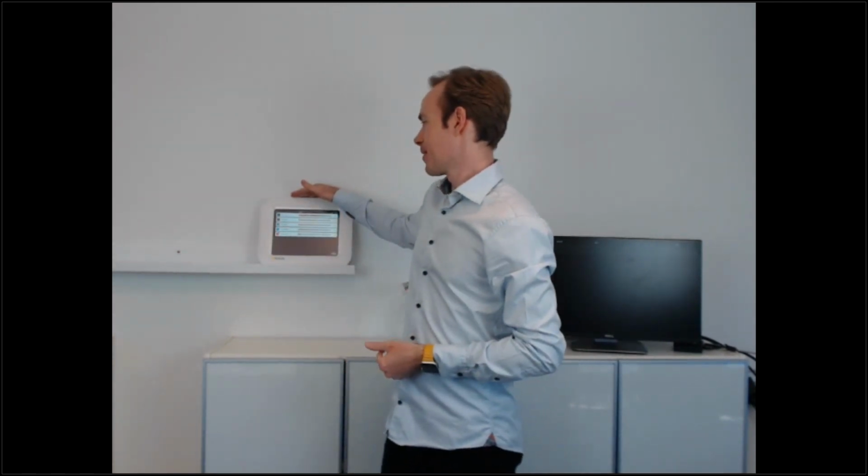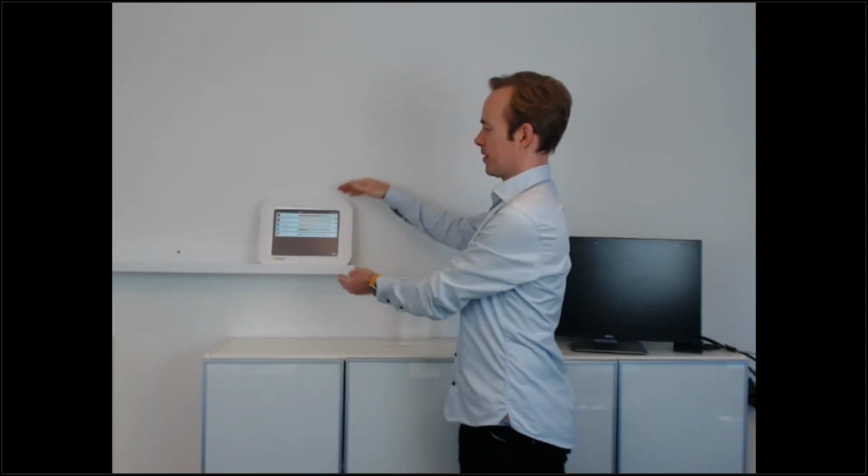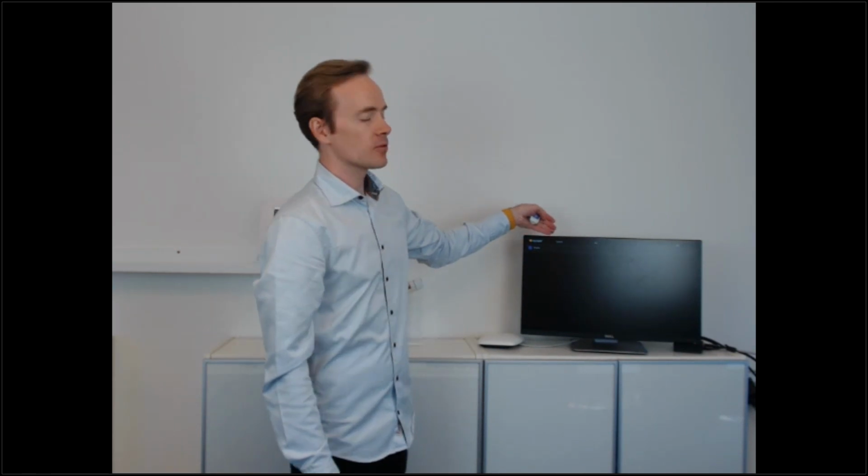And that's it. So RaySafe i3, we have the dosimeters. Let's look at that one again. This is how it looks. We have the standalone i3 with everything in one unit. We have i3 OSD, which allows you to use any display or video switch that you might like. And that's the whole system.